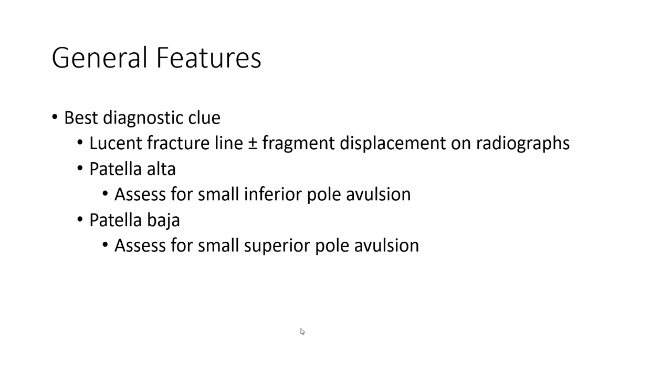Best diagnostic clue: lucent fracture line plus or minus fragment displacement on radiograph. Patella alta is assessed for a small inferior pole avulsion, patella baja for a small superior pole avulsion.